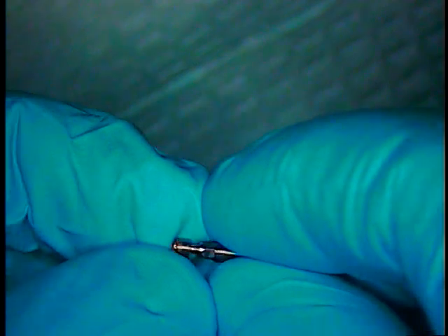This is a Biomet 3i case that was referred to me by a local dentist, and right now we're dealing with two things. We have a fractured screw fragment, and it's a conical abutment, one of the earlier ones — products that are no longer being made. The company was kind enough to call me back and work with me on identification, so we had to do this in order to find out where we're heading. First thing first: identify the parts.